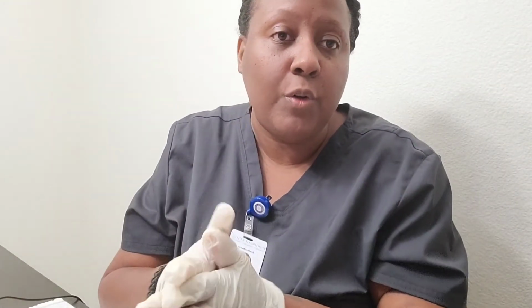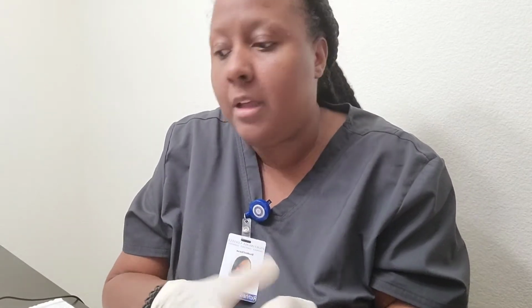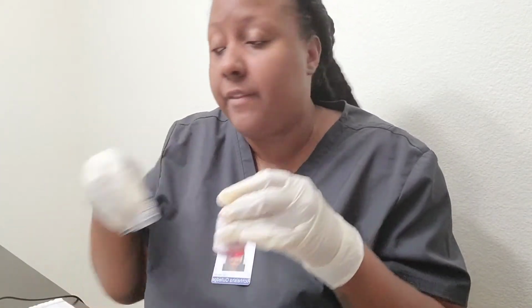But I do want to note, inside of my kit, those are the only vials that I received, just these 3. I didn't receive any more, and those are the only 2 syringes that I received in my package. So I would like to note that.